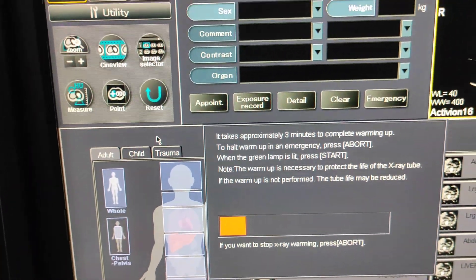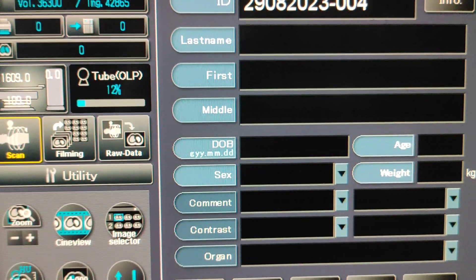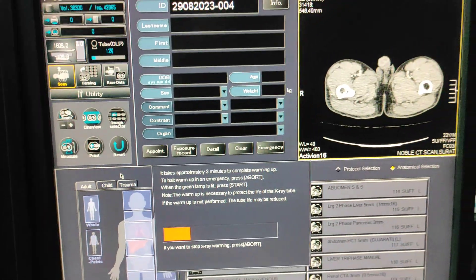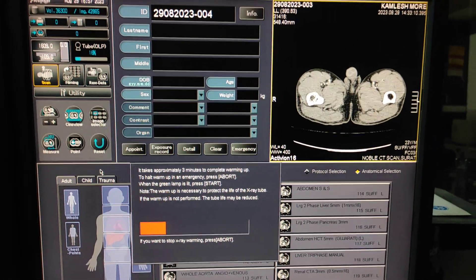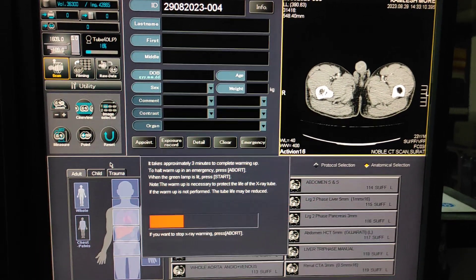You can check that the calibration is moving the tube OLP — it is now up to 12%. Whenever you are starting your system, always do this warm-up process before scanning for better quality images.